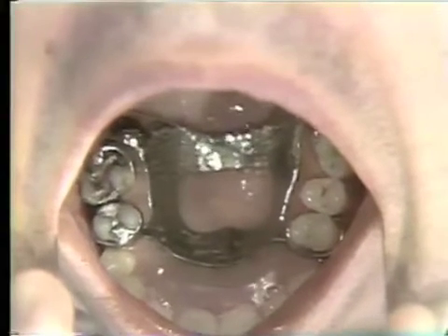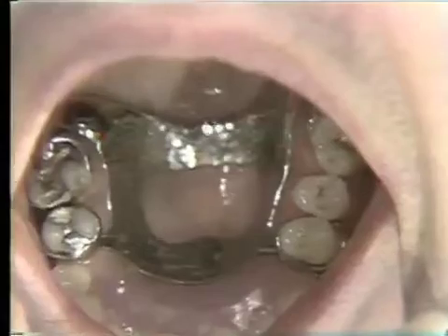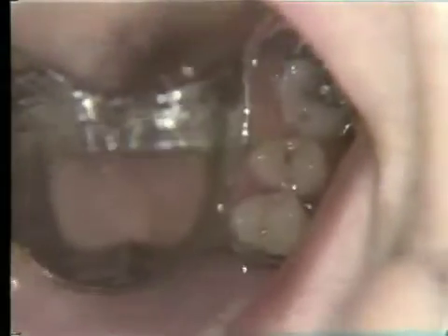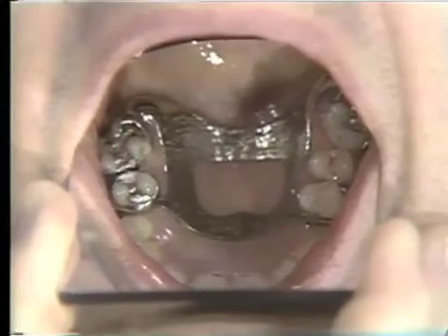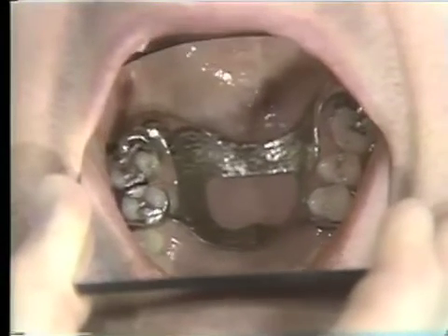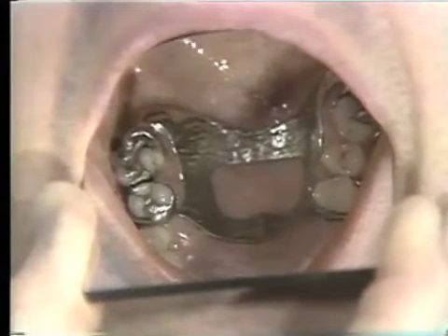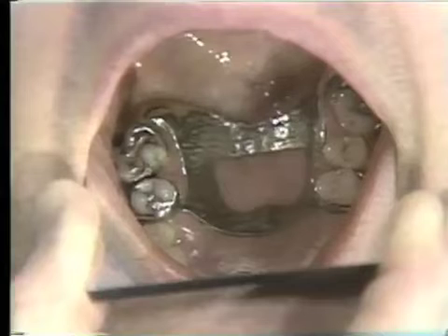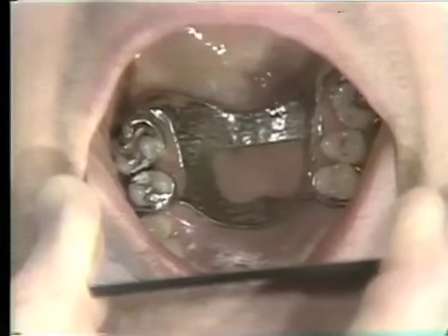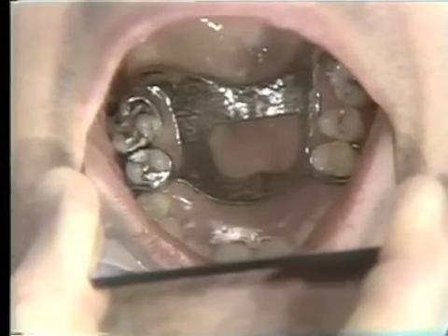The class 4 partial denture above was anchored on the left on the first bicuspid, and on a molar in the back. On the right side, he was anchored on a bicuspid and a first molar. The type of clasp used on the anterior teeth or bicuspids were wrought wire, and the clasps used in the posterior teeth were roach-type cast clasps.